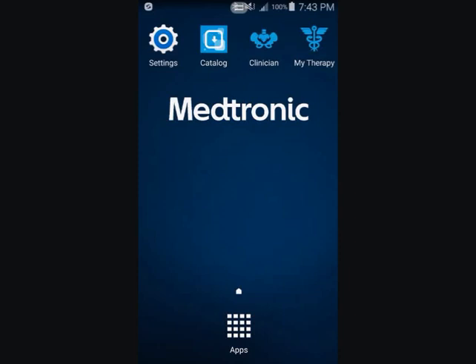The MyTherapy app is for a patient to use to control and monitor their therapy during therapy evaluation. This video demonstrates how to use the Patient app for an advanced evaluation.